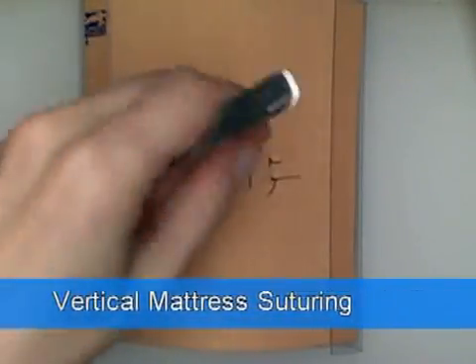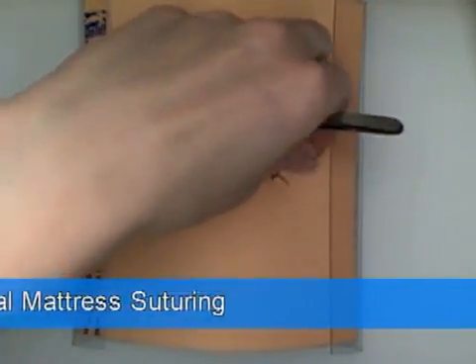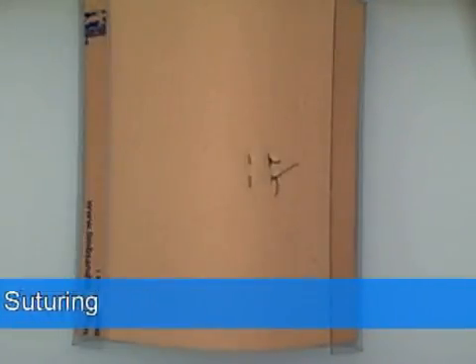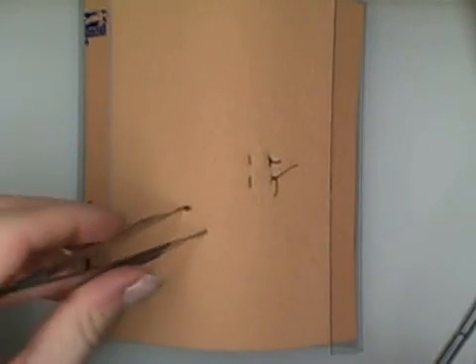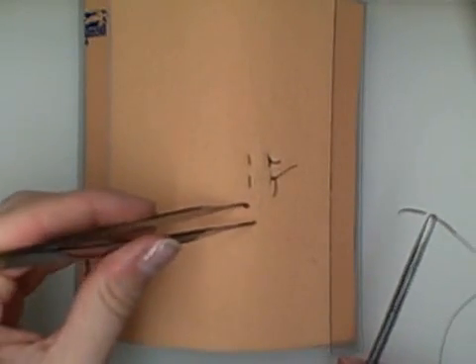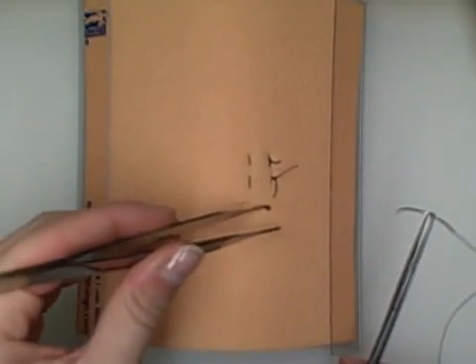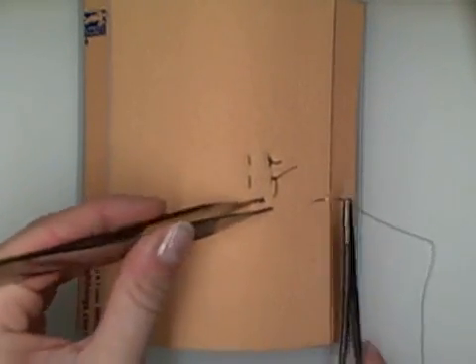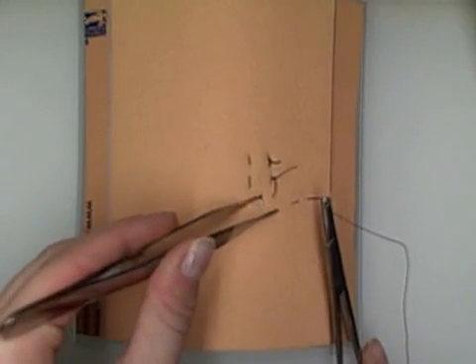Okay, so now we're going to do a vertical mattress suture. The vertical mattress suture is generally used to evert the edges.